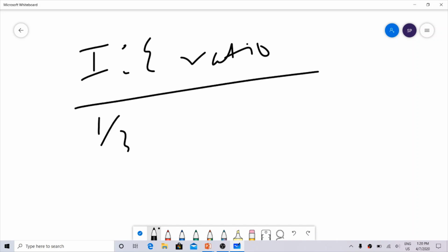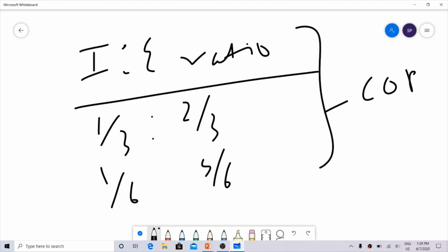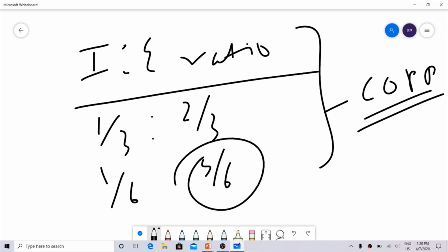Similarly, newer ventilators have a feature known as the inspiratory expiratory ratio. This decides how much time goes to each phase. Normally it is 1/3 and 2/3. You can reduce this, so you can say, I need this to be 1/6 and this to be 5/6. That could be done. This becomes simple. This particular setting is used only for COPD patients because they require longer exhalation, the expiratory phase. Initially this had to be calculated. When you use inspiratory flow rate, you need to calculate how much time is happening, but in newer ventilator settings, you can set this with the help of a ratio as well.